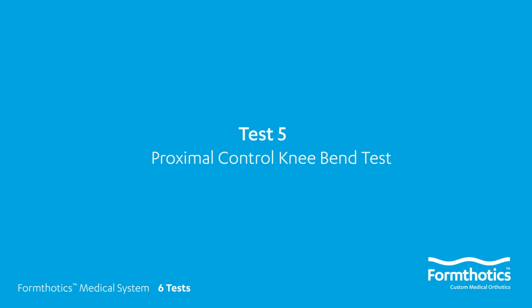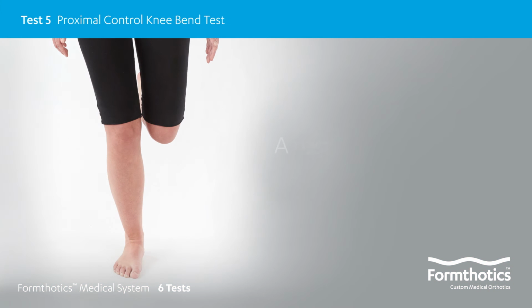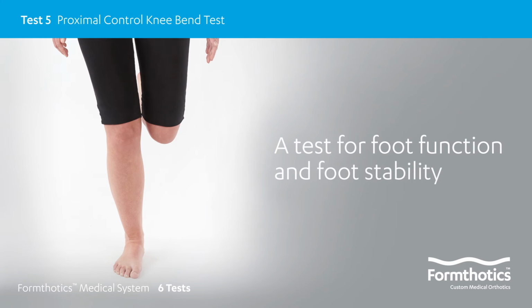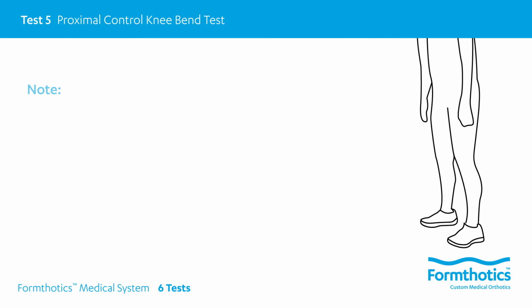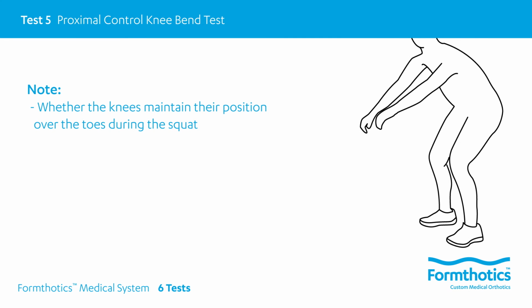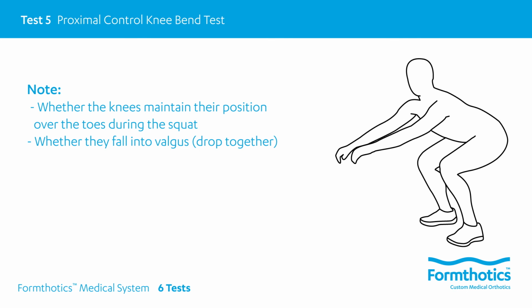This test provides the clinician with a wealth of information about what part of the body is controlling foot function and foot stability. The knee bend test can be carried out with the patient performing both a double knee bend as well as a single knee bend test condition. During the double knee bend, the clinician will note whether the knees maintain their position over the toes during the squat or if they fall into valgus, drop together.